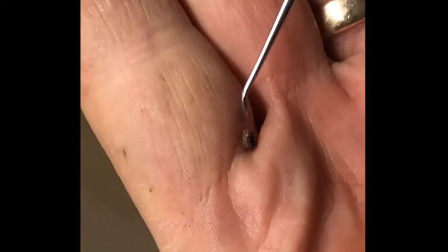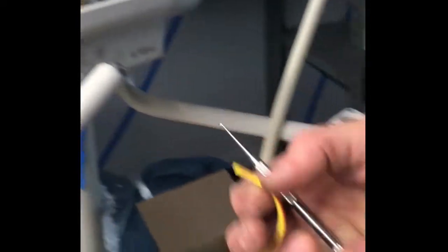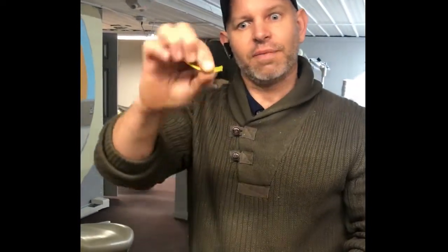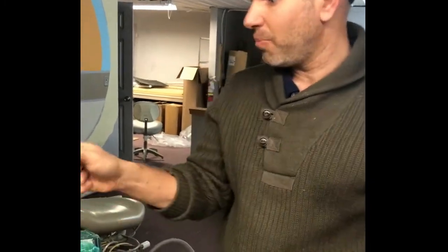Now here is the part that's amazing, all right? I'm going to take this piece of tubing and shove that in, and that hole is going to go over that narrow part. And this was so amazing when we did it earlier. We just looked at each other and couldn't believe it. So we're going to take this piece, shove it in there, move it around, and then I'm going to pull out, and what I'm expecting is that on the end of this is going to be that little piece. So here we go.